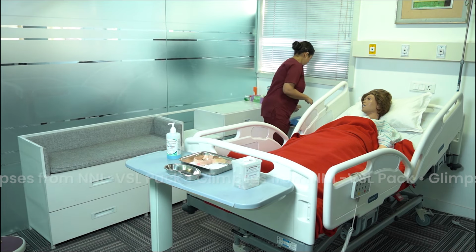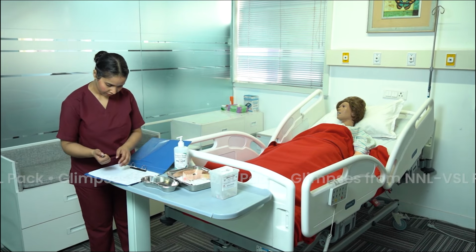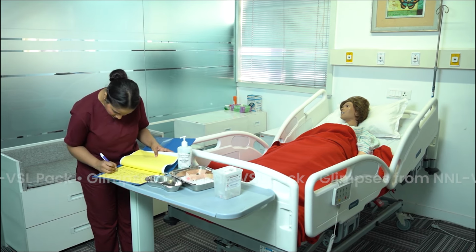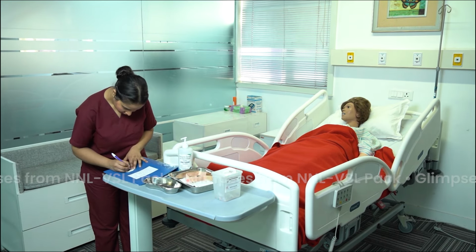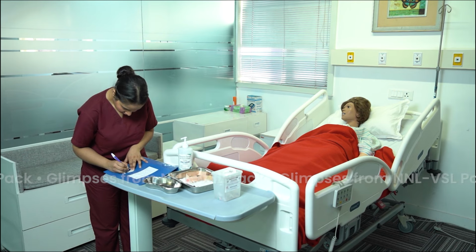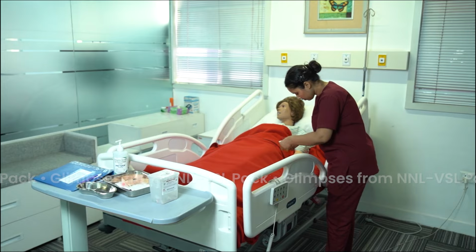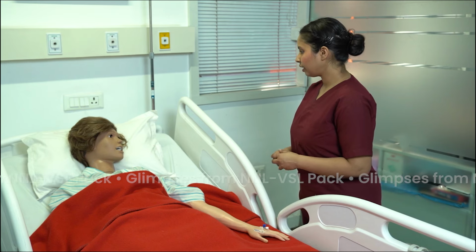Document the procedure in nurse's note, which includes date and review date, any problem encountered, and site and size of cannula and time. Okay ma'am, so I am done with your cannulation. You can take rest now.